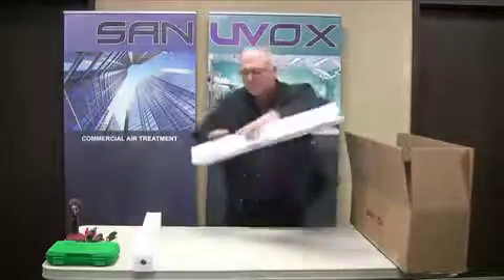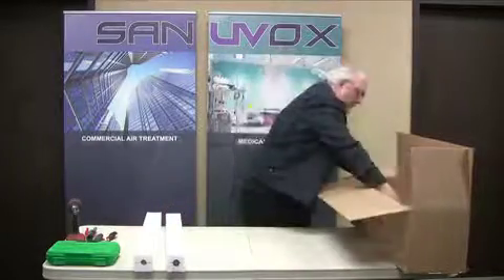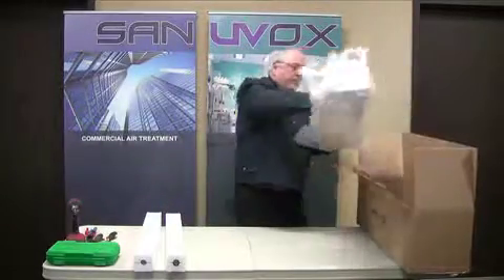Remove all components from the box. Inside you will find two lamps and one unit.